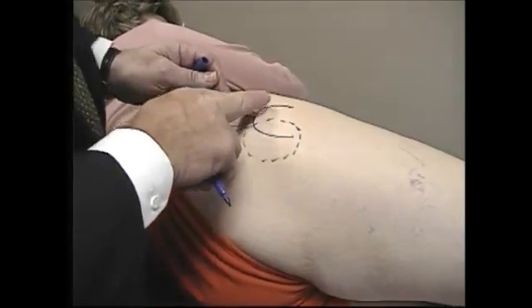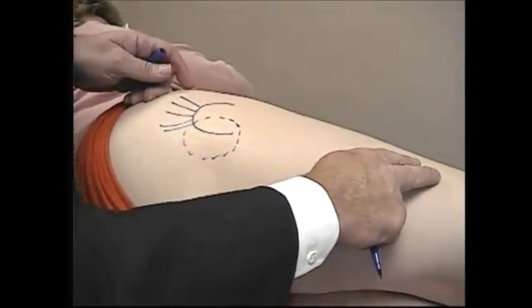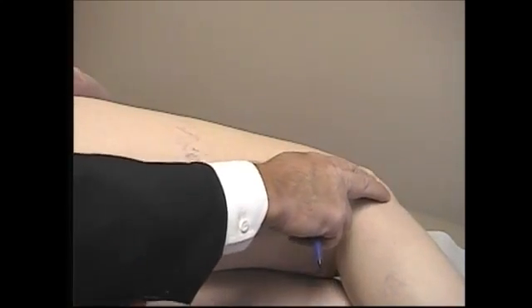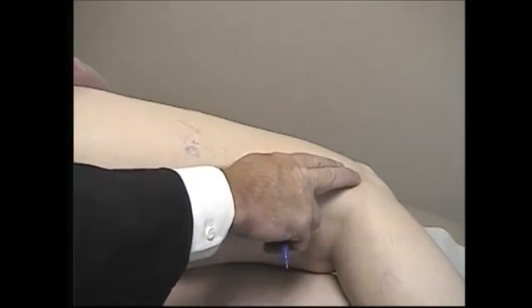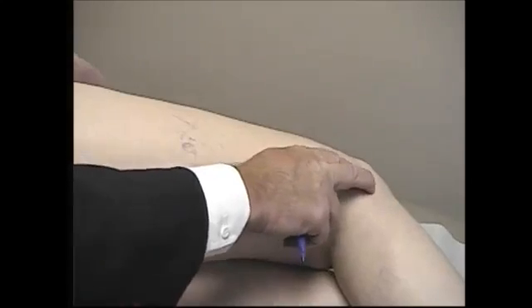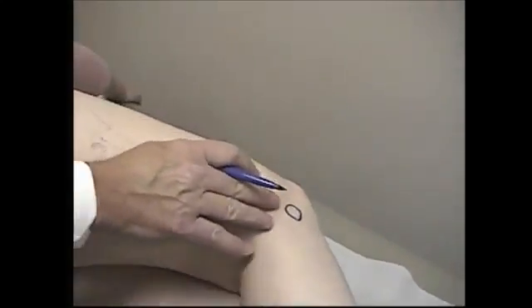In her case, she's radiating pain down into the knee along the IT band, and she has a little bit of bursitis now at Gerdy's tubercle, probably because she's changed her knee mechanics from the limping that she's been doing from her hip. So we're going to inject that also — we have the insertion of the IT band down here at Gerdy's tubercle.